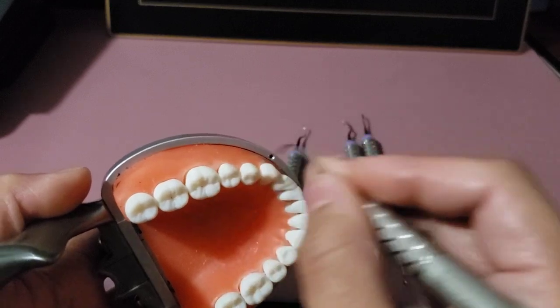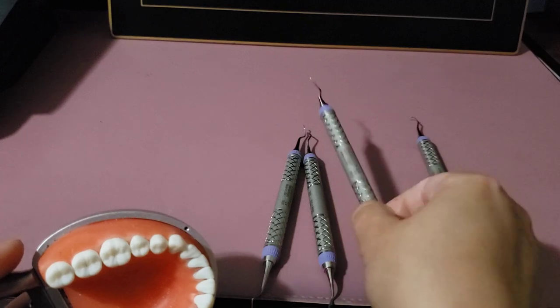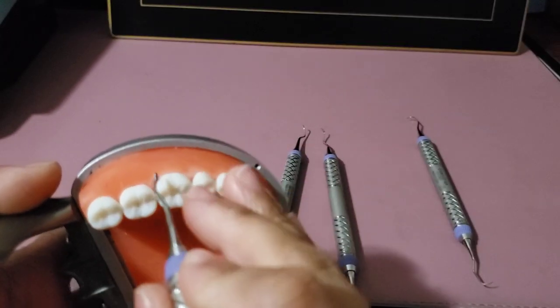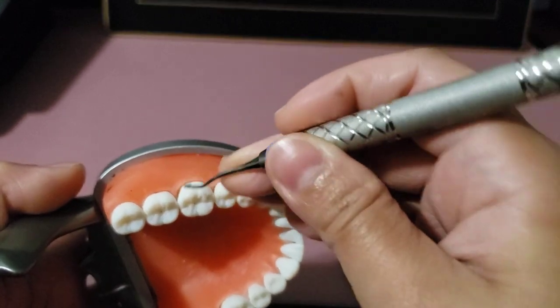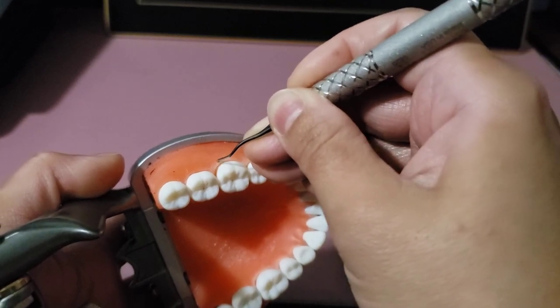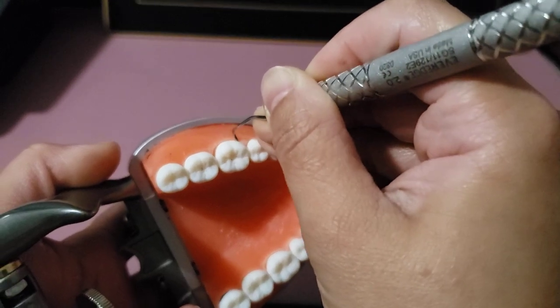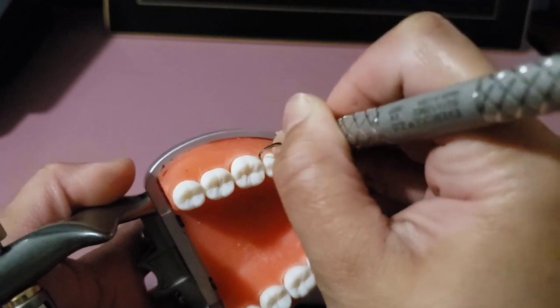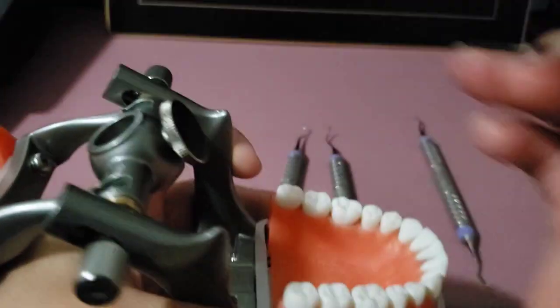For the next tooth, close, insert, open away, and repeat the same steps as you go on to the premolars. Then change the instrument to the 11-12 for mesial surfaces. Confirm by pointing the toe distally or mesially — close, insert, open away, and work on the mesial surfaces until fully in the proximal. This is the same for distal surfaces and other sections of the mouth.